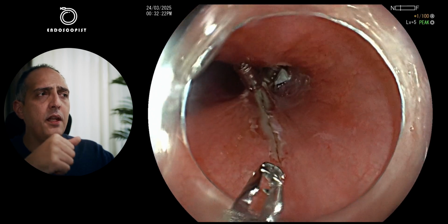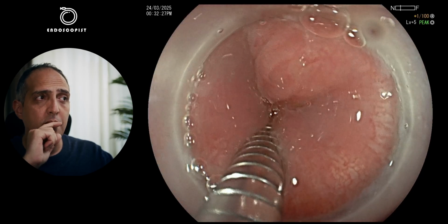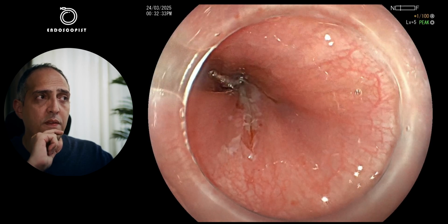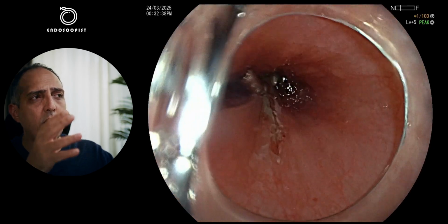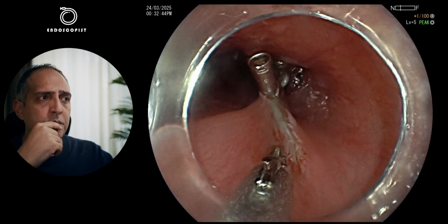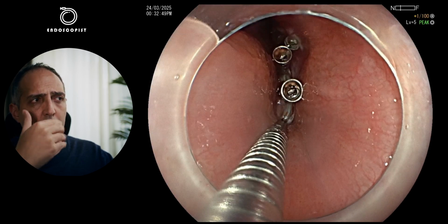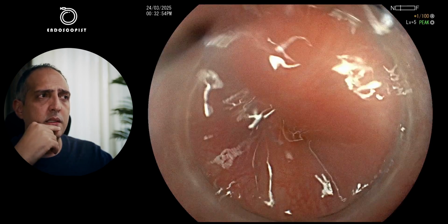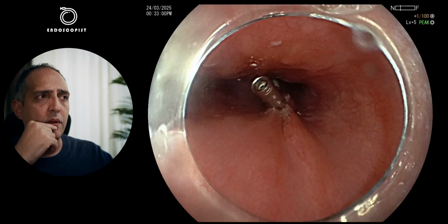And here again, another advantage of having a small and clean opening at the beginning of the POEM is the fast and safe closure and tight closure after the procedure. Usually it will take you something between 4 to 6 clips to close the POEM opening. Of course, there are some cases, when you have severe fibrosis or something like this, where you might use bigger clips or suturing or anything else. But in a normal achalasia case, normal small clips will do the closure.